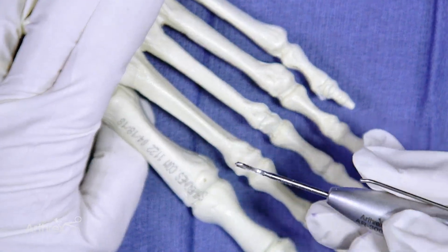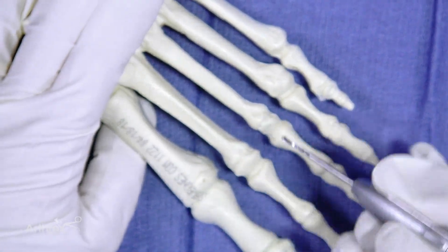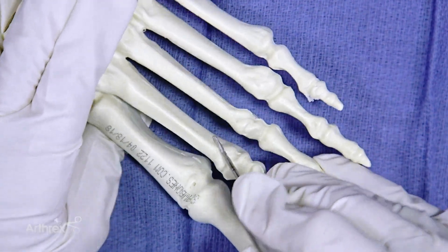This is the 12 by 2 millimeter burr. I'm going to put it in at about a 45 degree angle.